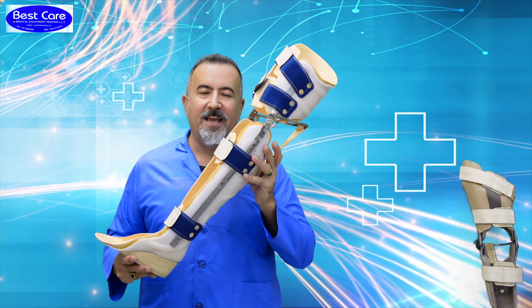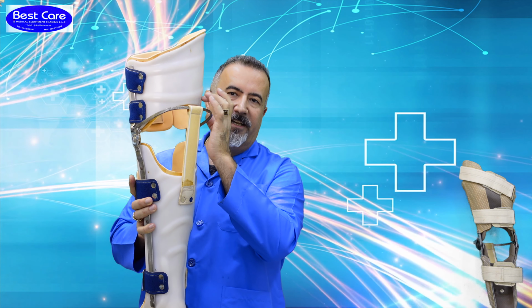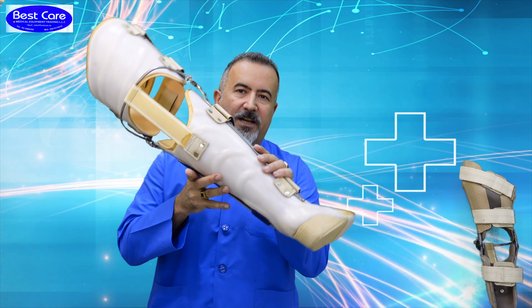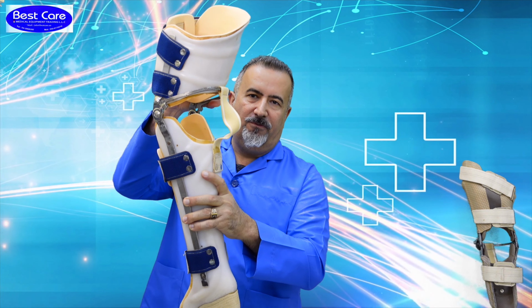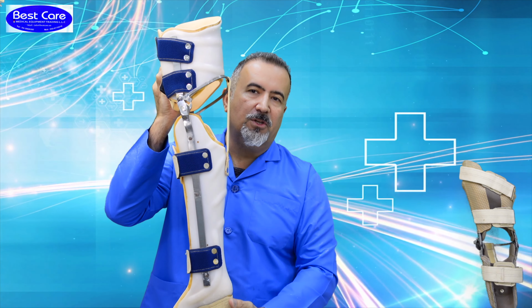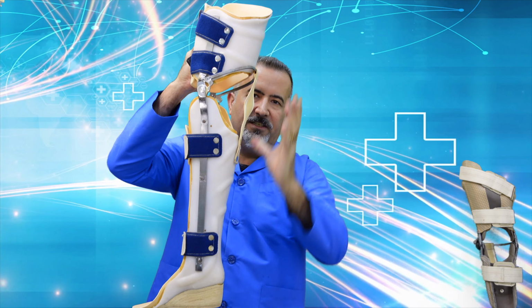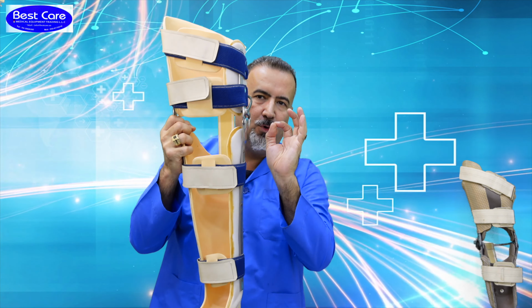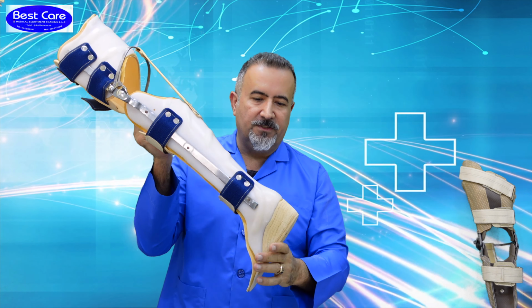In this KFO, you can see that the material is a milky color, and I'll come closer for you. This is polyethylene. In our orthosis, all the components used are from the company Ottobock from Germany. You can see here, this is nicely functioning. It's very nicely parallel to each other. It is very important that the patient will have a more comfortable gait while using this one.